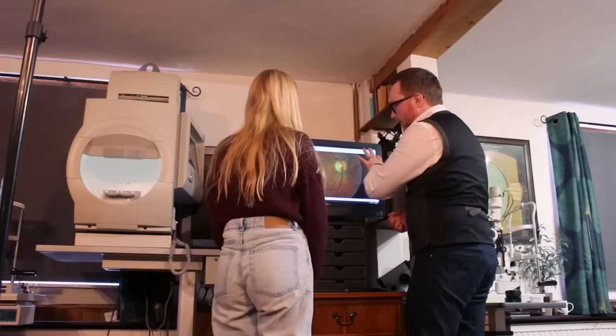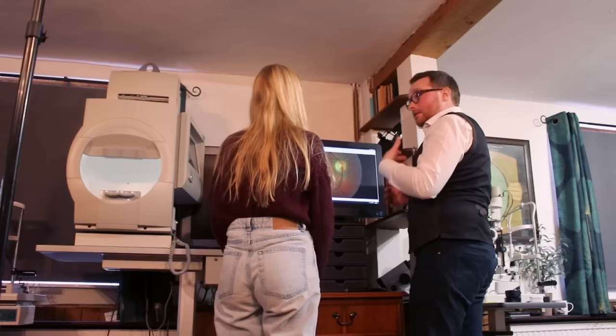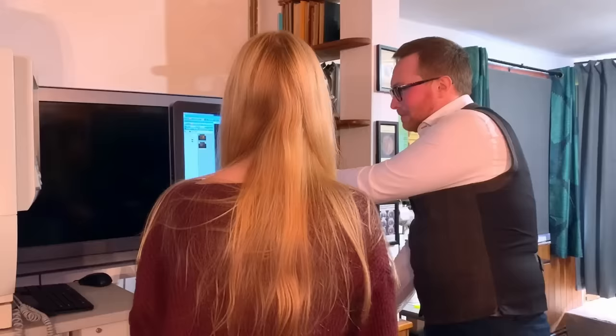The retina is the only place in the human body where we can actually photograph blood vessels. So it's a really good way of us being able to monitor cardiovascular health, things like high blood pressure, diabetes, risk of stroke, etc. Because it is such a non-invasive way of us actually imaging blood vessels as they are. So thankfully no signs of any of those today. All looking okay.